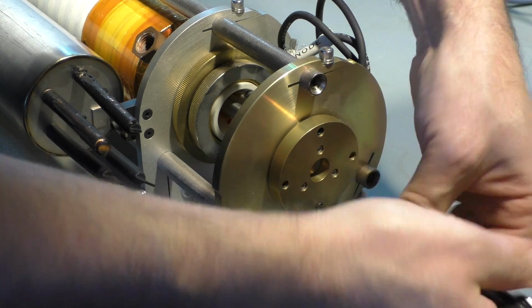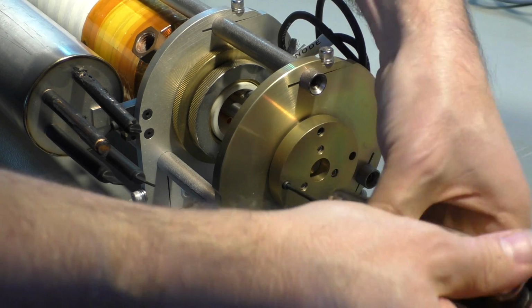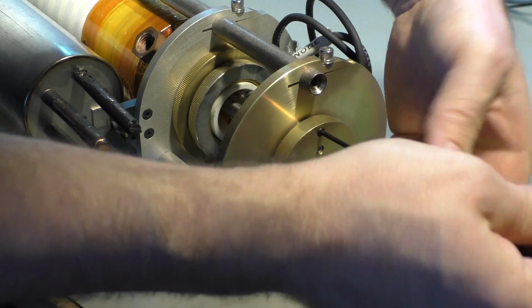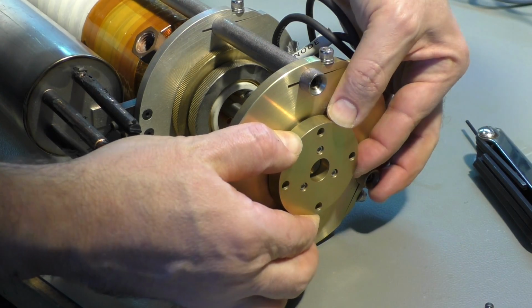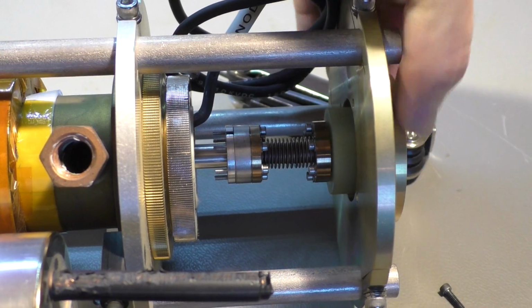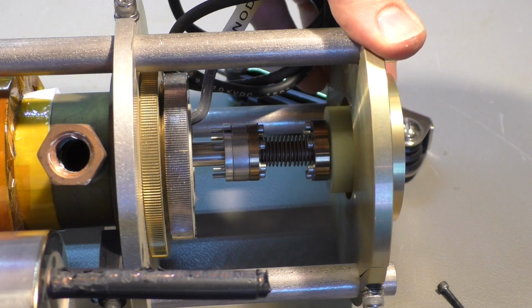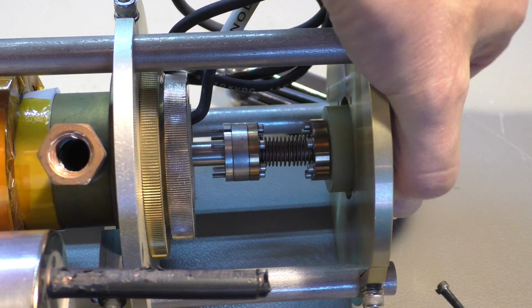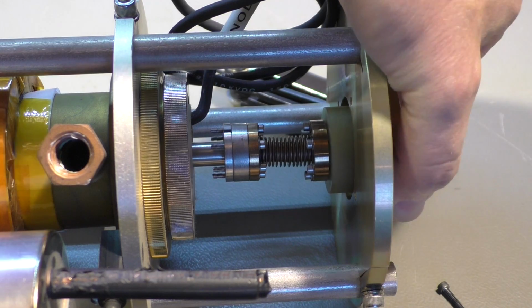So now, after removing these screws, the whole assembly is not adjusted anymore. But since this tube will not work anyway, it's not a big problem. So, can we move that? Yes. You can see that I can move the mirror, and this bellows-like thing here just allows me to do that, while it keeps everything airtight, and I think dust tight is more important in this case.